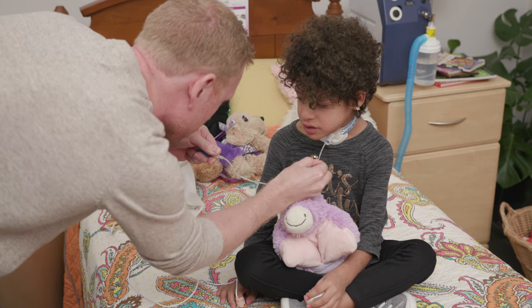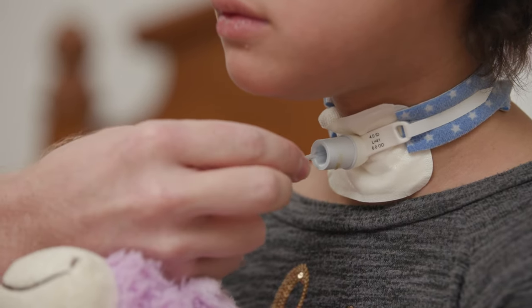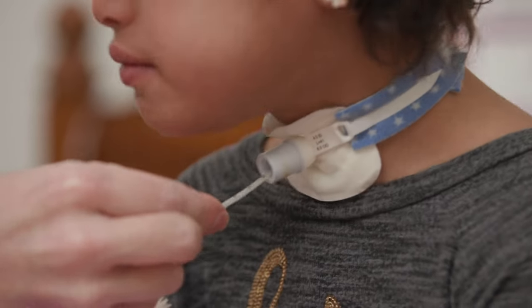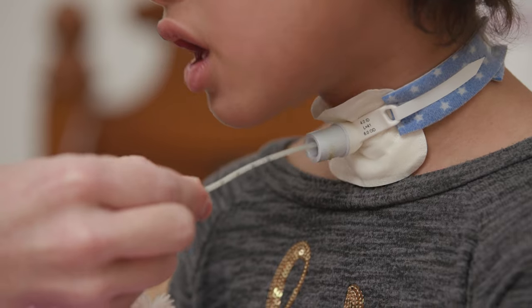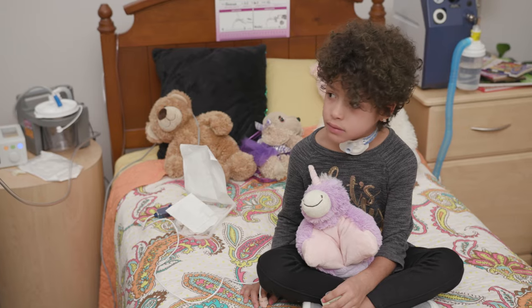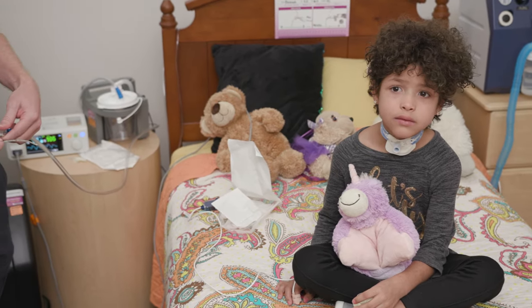Slowly remove the catheter in a swirling motion. Be careful not to touch the part of the suction catheter that goes into the tracheostomy. Suctioning your child's tracheostomy tube should not take more than 4 to 6 seconds. Repeat suctioning steps as needed, allowing 30 seconds for your child to catch his or her breath between each suctioning.